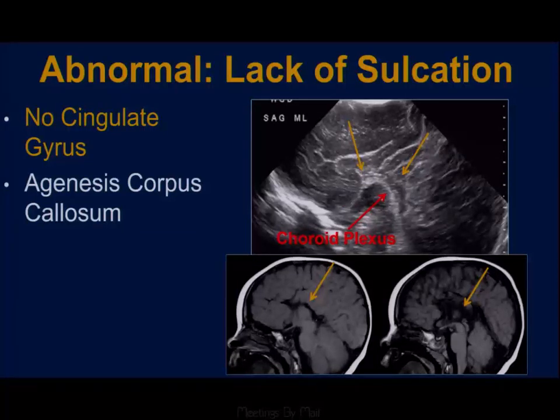Because after all, neonatal head ultrasound is really a screening exam. And so if you see anything abnormal, please have a low threshold to move on to more correlative imaging to make a diagnosis.